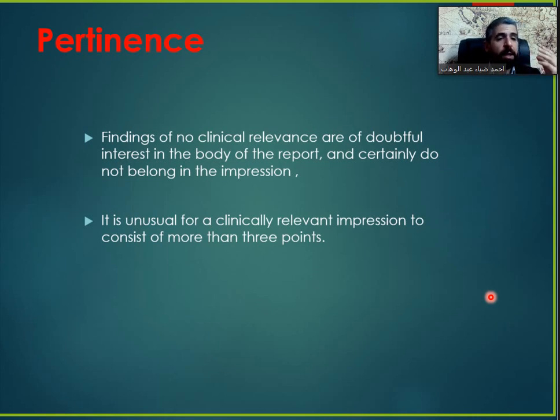For example, multiple stable renal lesions that are too small to characterize in a patient with a progressive lung metastasis. Okay? What does that mean? Another example, dependent atelectasis. Dependent atelectasis is very common. We see it in many patients who are normal. Patient lies on his back, there is some atelectasis at the base. So do not write this unless it is severe or it indicates an infiltrative or interstitial disease. Just normal dependent atelectasis is normal. Don't write dependent atelectasis seen. It's confusing and it's not important.